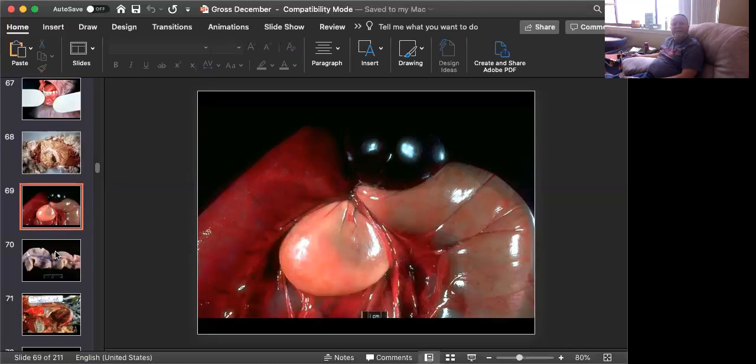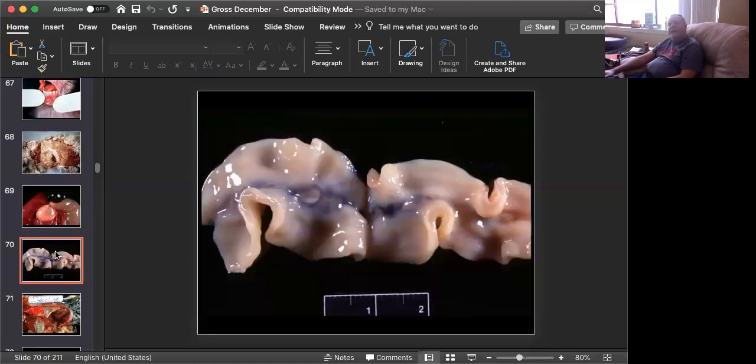Slide number 7 is tissue from a cat. Can you give me the cause? Okay, time's up. This is a great one. You don't have to have a lot of pathology training. If you have a good mind, you're going to figure this one out pretty good. This is a fixed section of intestine, and it is very plicated.